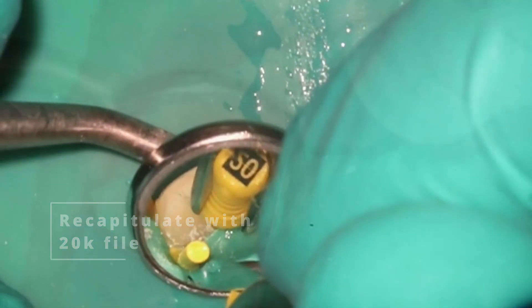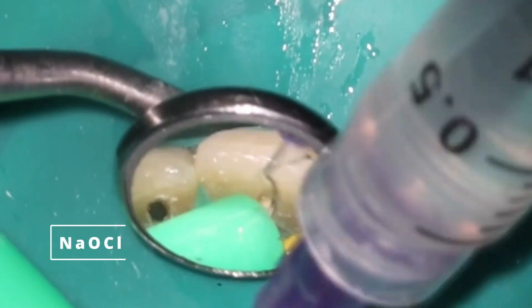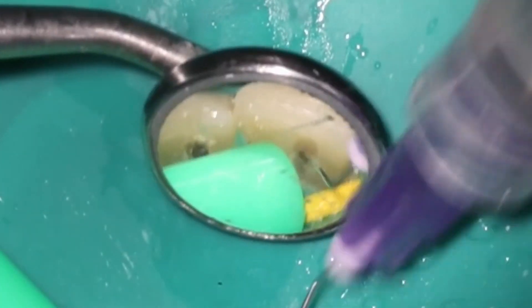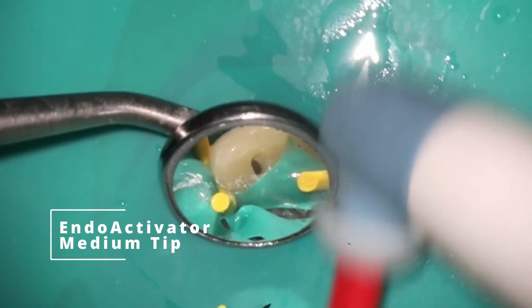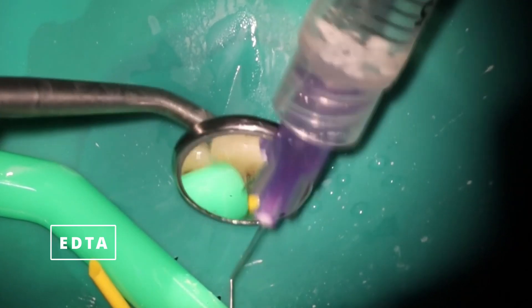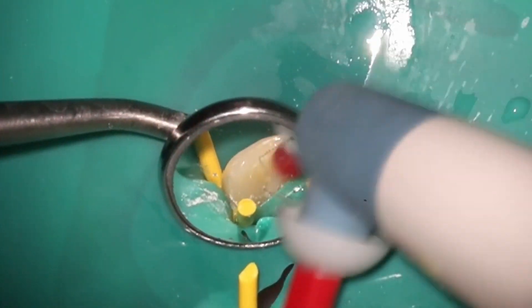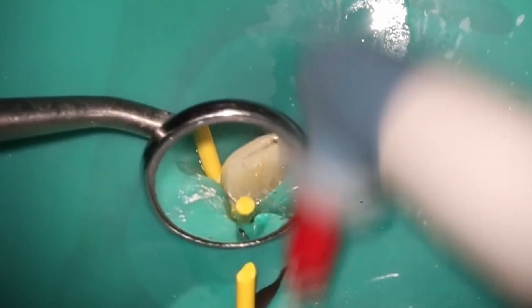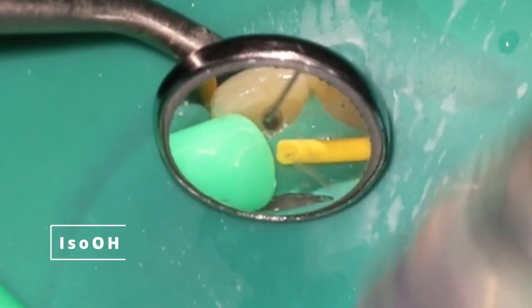Go back and recapitulate with that 20K file. This case was very wide open so I'm not too concerned about it. Then we're going to do our rinsing process — I sped this up because no one really wants to see me rinse out teeth all day long. Pretty much you're going to use bleach, then go with the activator, and then come right back in with EDTA. The reason I like to do this combination is it not only prepares the teeth really nicely but it also gets all that calcium hydroxide out of there. You don't really want to leave any of that behind. The final rinse is always going to be with isopropyl alcohol — it dries just beautifully and you don't have to use as many paper points.